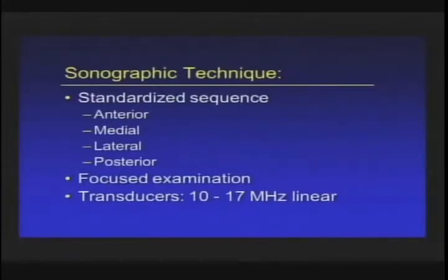The last point I want to make is if you're trying to understand subtle pathology, the only way to get used to that is to understand normal anatomy. So if someone is looking for an ulnar collateral ligament tear, that shouldn't be the first patient I've ever examined for the UCL. I want to look at the UCL on many, many people, even without pain there. Because if you do a comprehensive exam and you're scanning areas that aren't abnormal, it really is not that slow to do when it's really normal. It can be very quick.